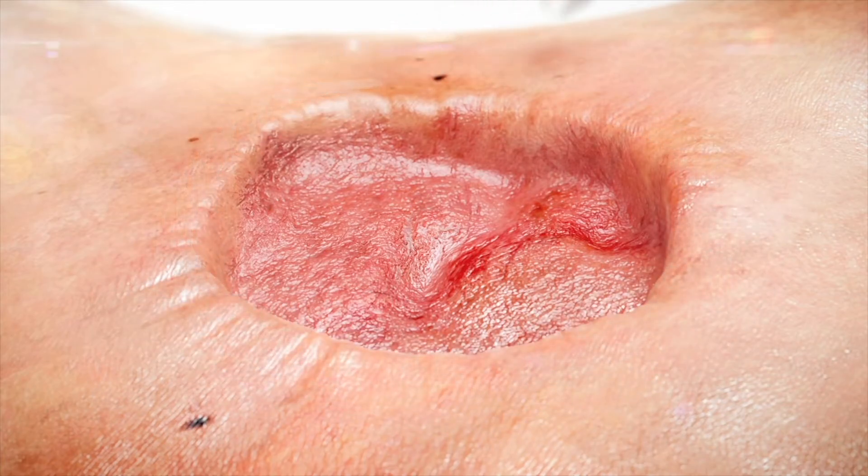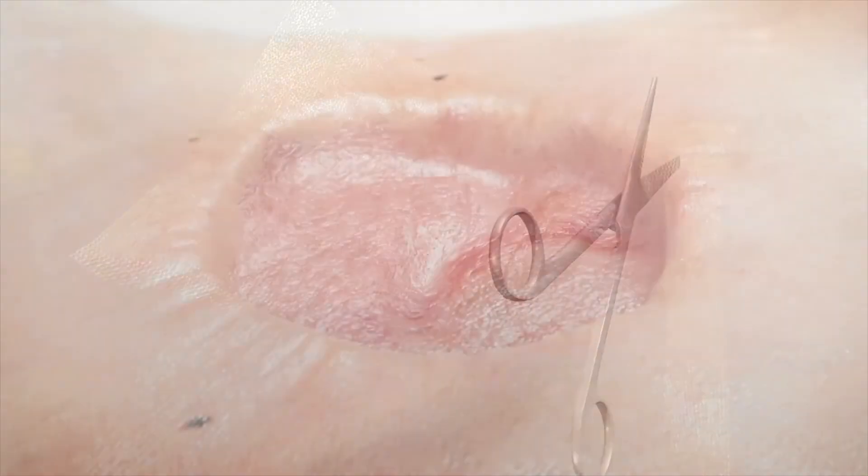If desired, a non-adherent dressing may be applied to the wound bed — not included in the dressing kit. Trim a layer of non-adherent dressing and lay across the wound bed.